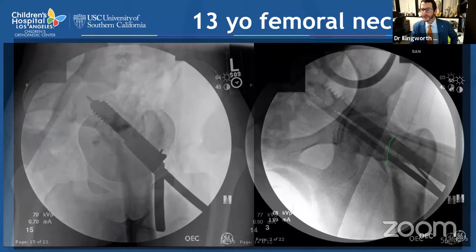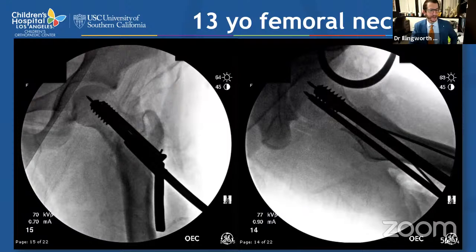So here are the intraoperative radiographs from the outside institution. You know, the AP doesn't look that bad, right? It looks close to anatomic, but when we look at the lateral radiograph, we can appreciate it's not an anatomic reduction. Certainly there are anterior and posterior cortical step-offs, whether it's a rotational malalignment or otherwise, but certainly not truly anatomic positioning in this particular case.